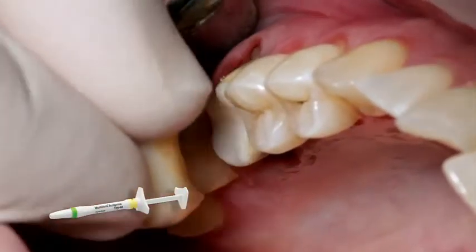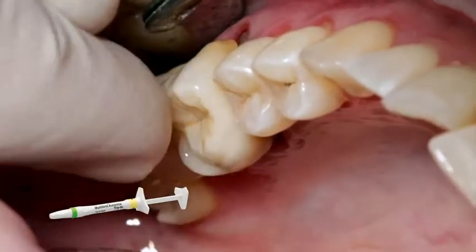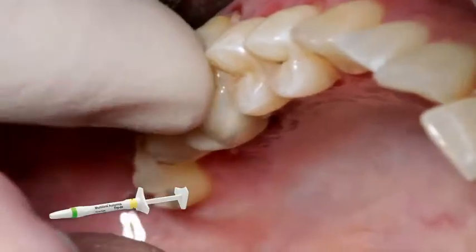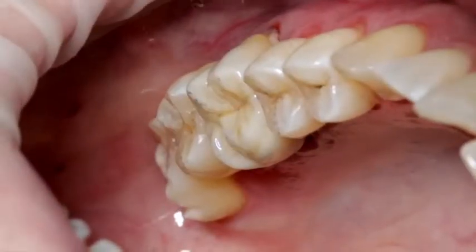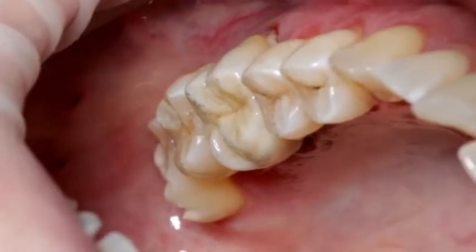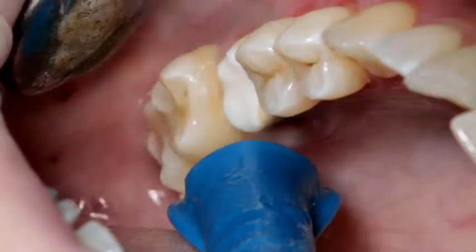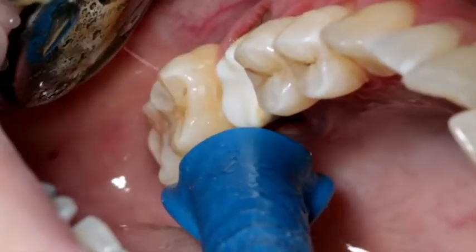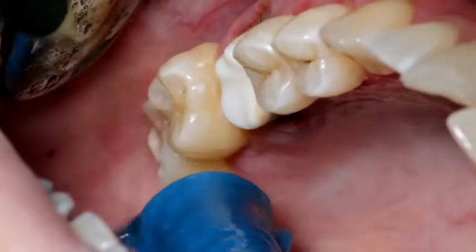For optimum aesthetic results, check the shade of the restoration with Multilink Automix Try-In Paste. When trying in the permanent restoration, check the shade effect, the accuracy of fit, and the occlusion of the restoration. After the try-in, thoroughly rinse the try-in paste with water spray and dry the preparation with air.